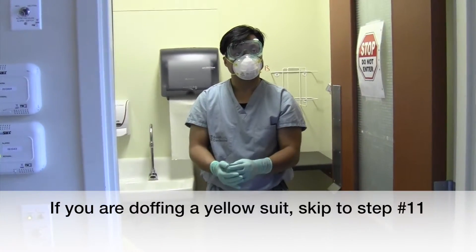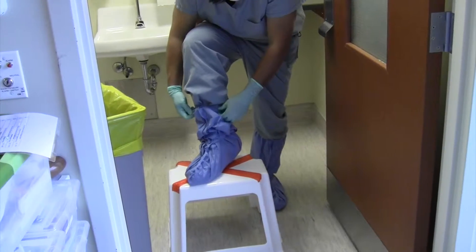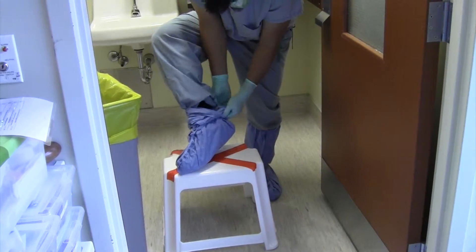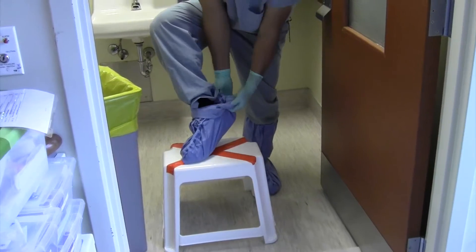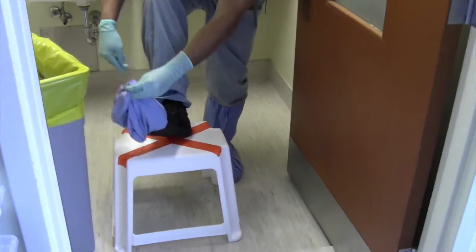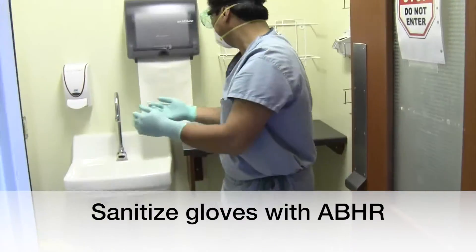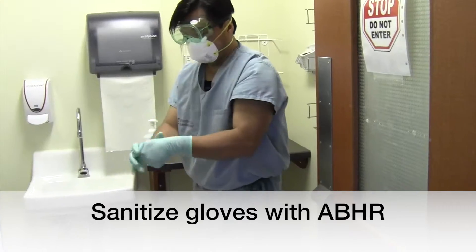Step 10: Remove the leg covers inside out and discard. Do this by grasping the outside of the leg covers and rolling down towards your foot. Sanitize gloves in between each leg cover removal.